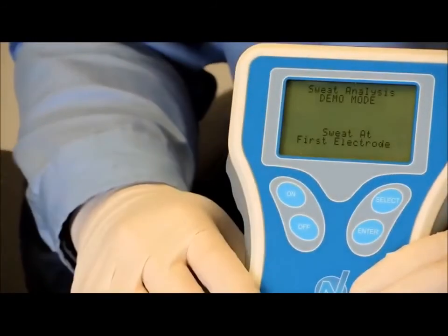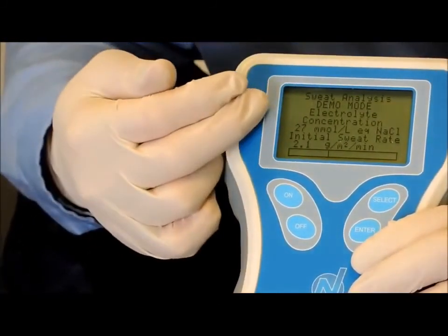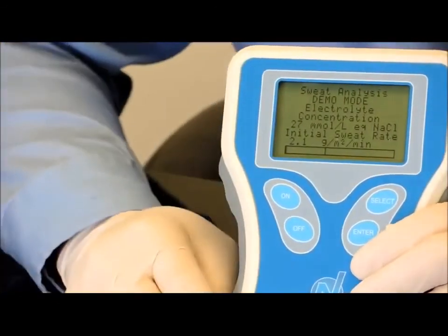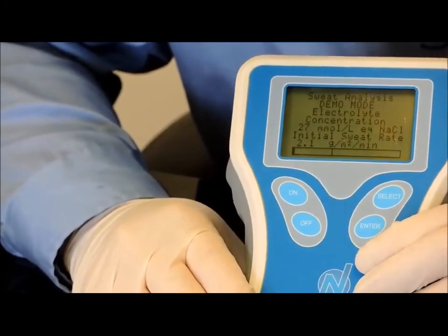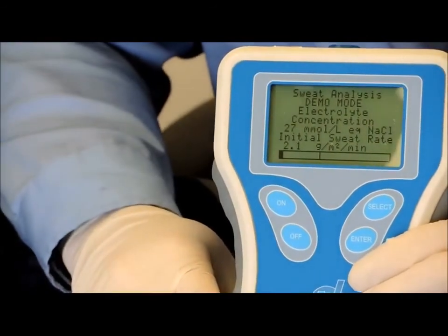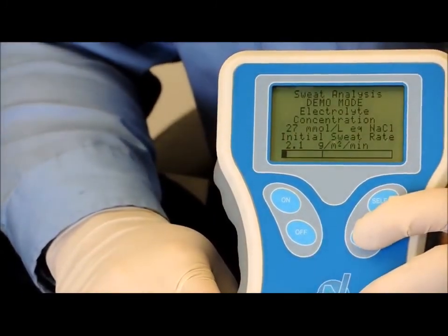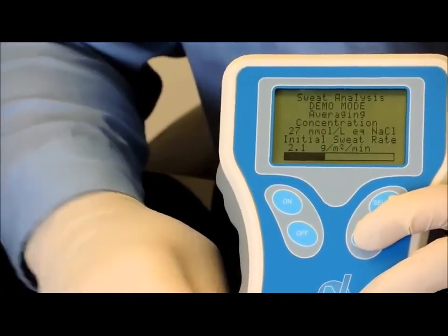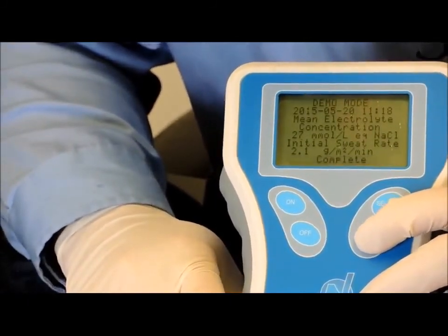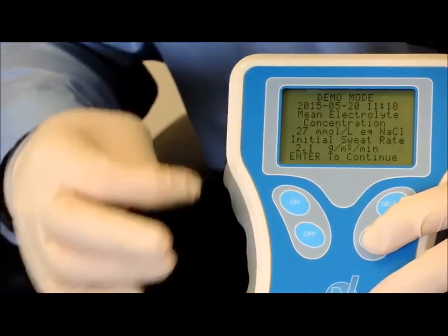And I'll press enter. Now you see sweat at first electrode. I'll press enter again, and now it's showing a value of 27 and a sweat rate of 2.1. Again, those are just random values that appear as you're showing this to a customer, and it has the 8-minute progress bar, like you normally would expect if you were actually collecting sweat. And you can just continue to hit enter, and it automatically progresses through the next step all the way to completion.